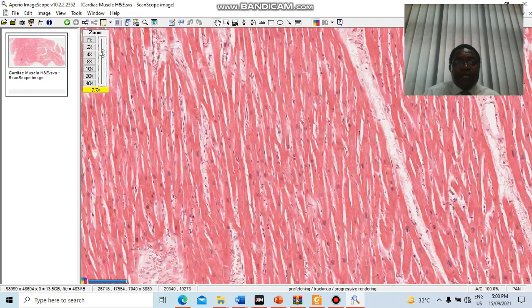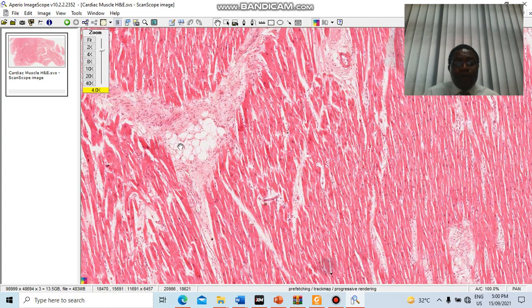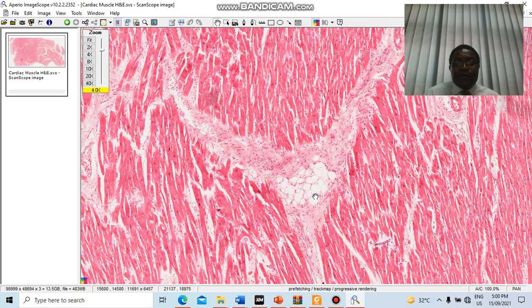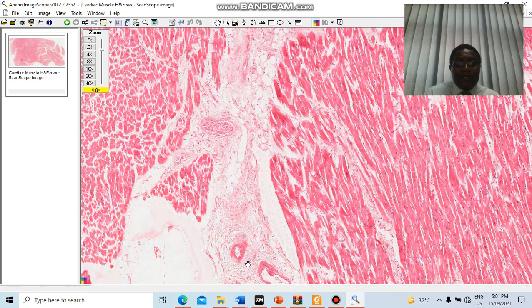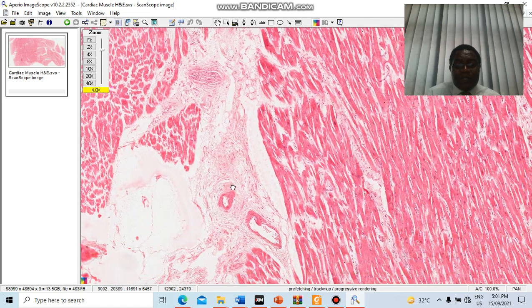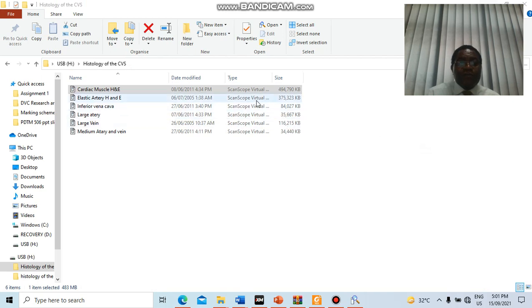We did also see parts of the epicardium, and in places between the muscle sheaths there are ghost cells here, which are the remnants of adipocytes or fat cells. You can see connective tissue here with a lot of fibrocytes. You may not always see or distinguish the epicardium. Here there are blood vessels in the heart, and we can see spindle-shaped cells here as well. So let me hurry on now to show the large vessels.